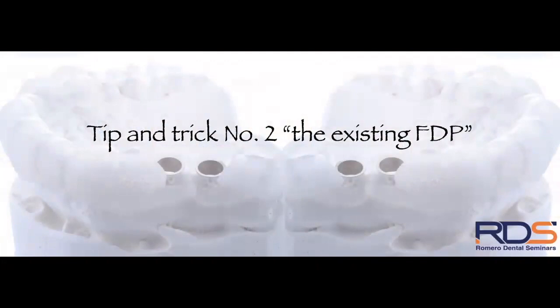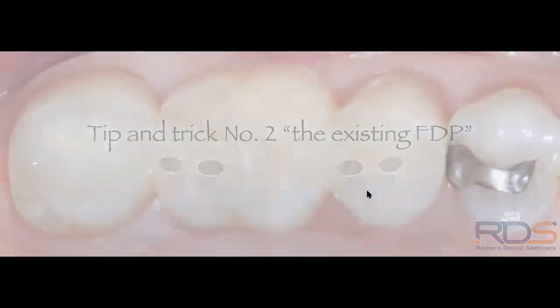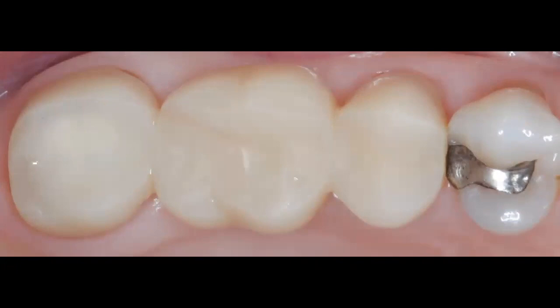So this will take us to our tip and trick number 2, which is using an existing fixed dental prosthesis as your surgical guide. And again, you are seeing here, this patient presented to the clinic. She had an existing zirconia fixed dental prosthesis that was giving her some issues, so we had to remove it. What I did is I literally took an impression of the actual prosthesis and used that to make my temporary prosthesis. And that's what you're seeing here.